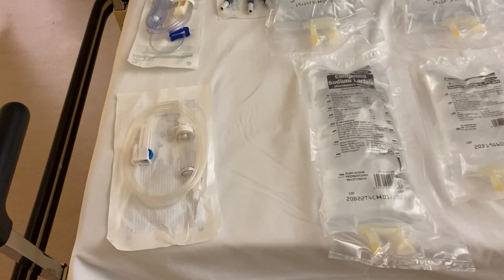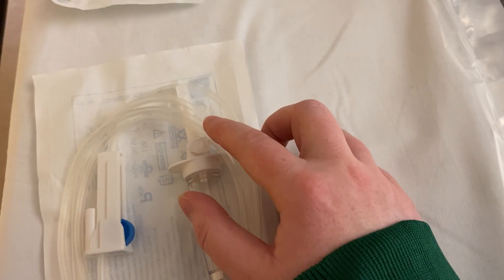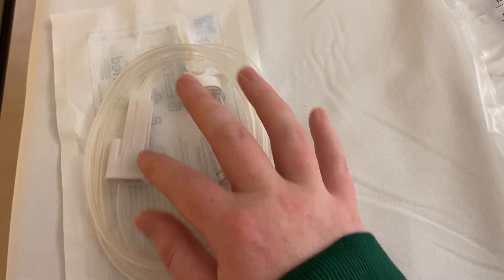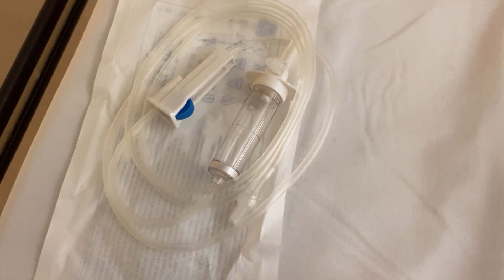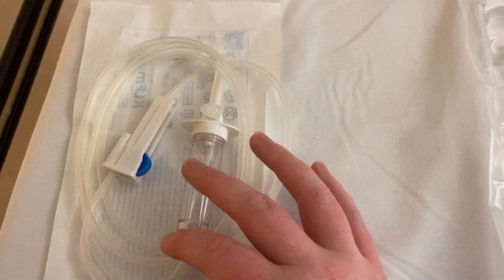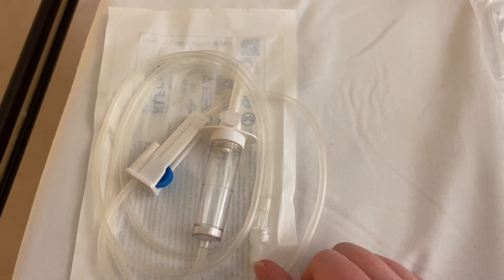Starting with the giving sets — this is a normal regular giving set where we use the spike up the top to spike the bag and run fluids through. This part is open and this is closed, which compresses the tube. Run the air all the way out by running fluid through, making sure there's some fluid in your little well here. Spike your fluid, fill the well, and let it run through.